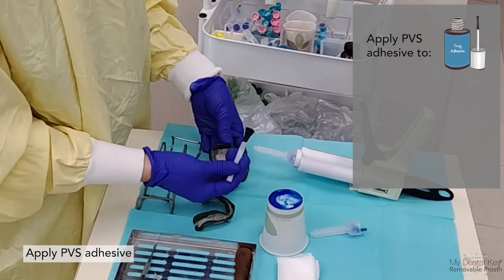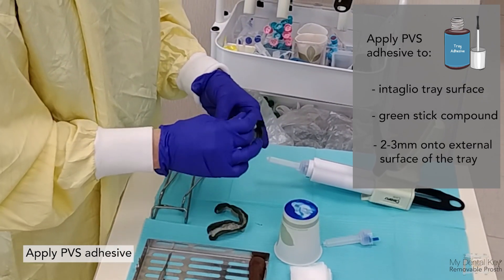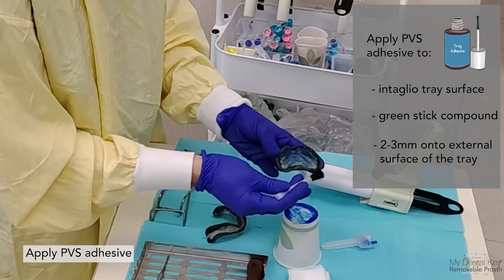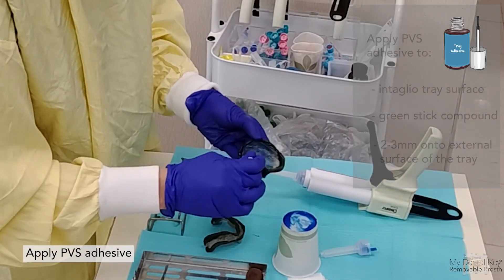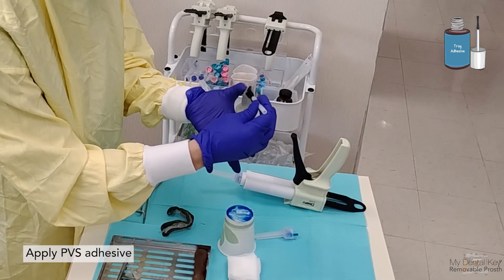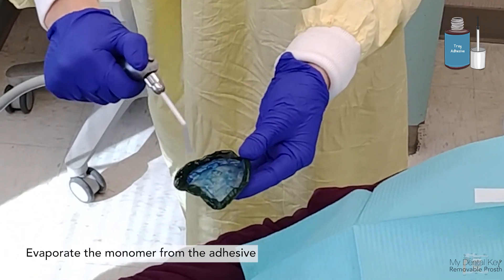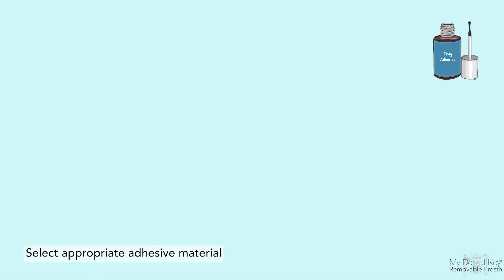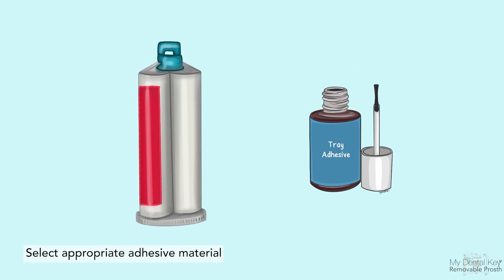Apply one coat of PVS adhesive to the intaglio of the tray, green stick compound, and two to three millimeters onto the external border of the tray if the green stick compound or border-molded material does not extend to this region. Ensure the tray is dry before applying the adhesive, and use the air-water syringe to evaporate the monomer after applying. Ensure you have selected the appropriate adhesive for the final impression material — PVS adhesive for PVS material.